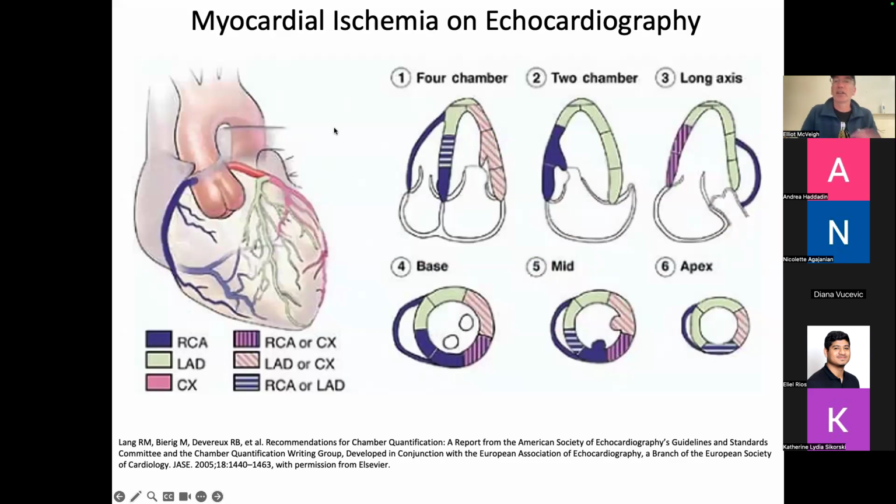Okay, so that's echocardiography for functional imaging, Doppler, guiding therapy. We saw a whole bunch of things. And then there we saw it for managing whether or not a person has thrombus before doing a therapy. And everybody in the hospital who gets defibrillated is tested for whether or not they have a thrombus first. So they can either go to CT, most of the time they just go to echo because that's in cardiology. And you want those to be good pictures.